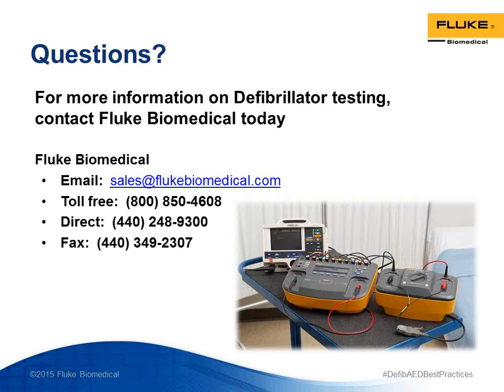Wonderful. Approximately how many shocks should you get out of an AED? Oh, that's a good question. It's going to vary with the make and model, and it's going to have guidance and guidelines that come from the American Heart Association and other clinical sources that have done great clinical studies on that. You certainly need to get at least 3 full energy shocks out of it, but generally you can get some more. But please look at the operating instructions of that AED and its specifications, because that's where you'll find that answer. And assume that it's going to vary until we prove it differently.